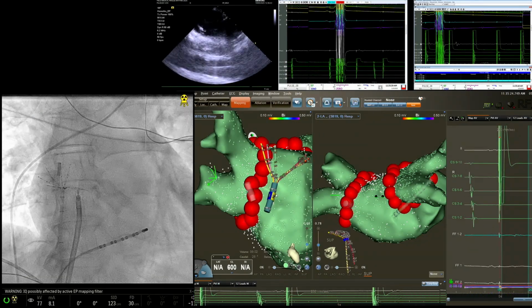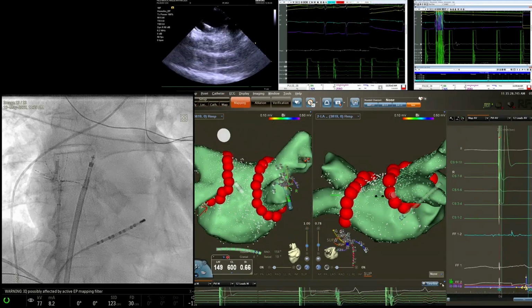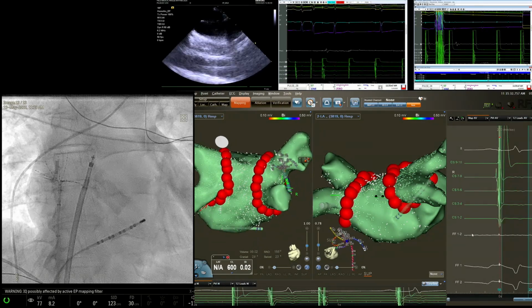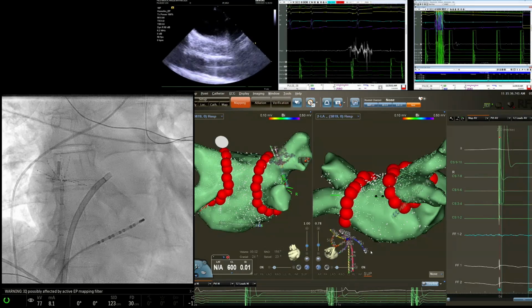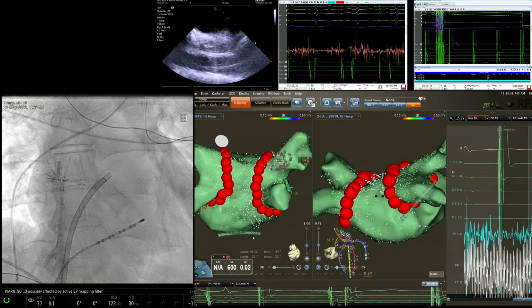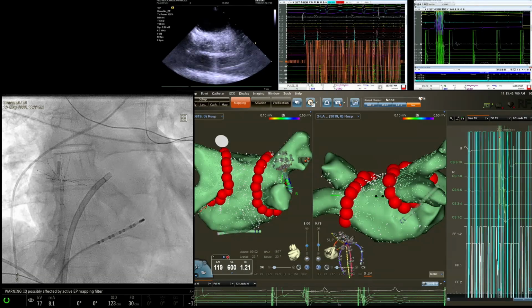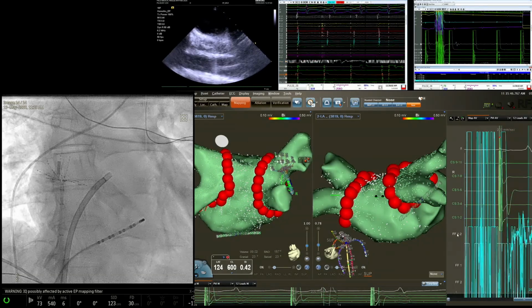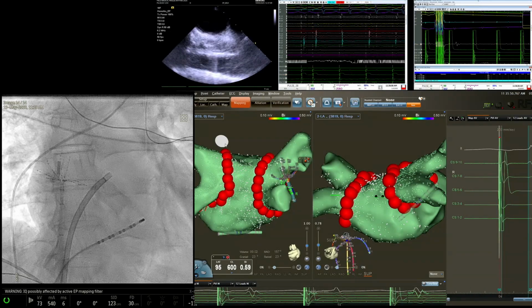Now you can imagine a situation where it's not so clunky. By the way, it's isolated. I didn't really show you, but we can put the catheter inside. What we'll do is switch and put the octave and map. While Honza does the mapping here, I want to show you what this should look like. So I'm going to go there, and then we'll come back. We still have to do a flutter line, actually. So we're going to show you a flutter line right after this.